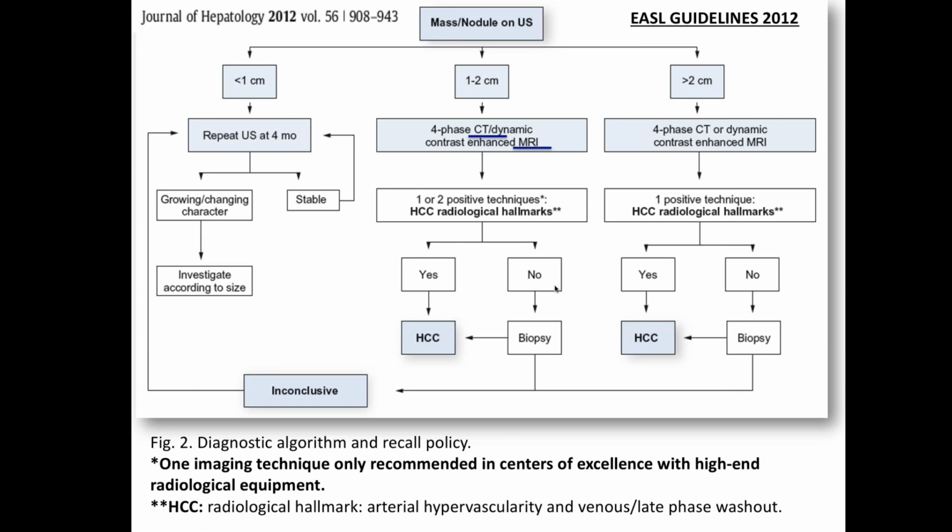For instance, a patient might have 3 different lesions, and often it is difficult to take a biopsy in all of them. So we might take a biopsy in the biggest, but then we don't know what the smaller ones are. So it is important to grade the risk of being an HCC and not only to have a black and white HCC or not HCC landscape.